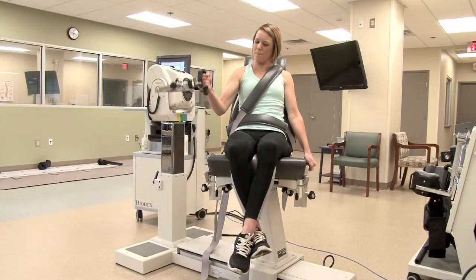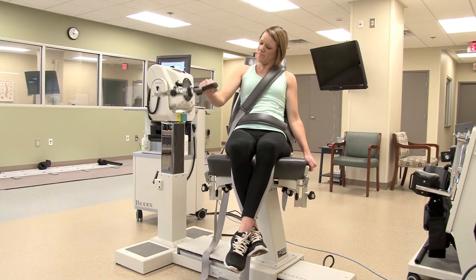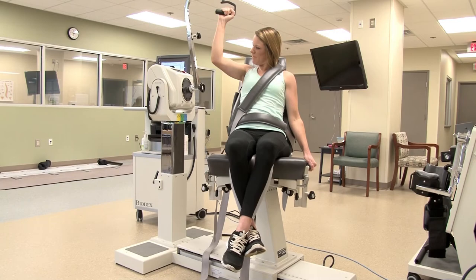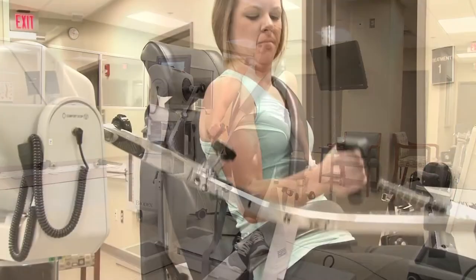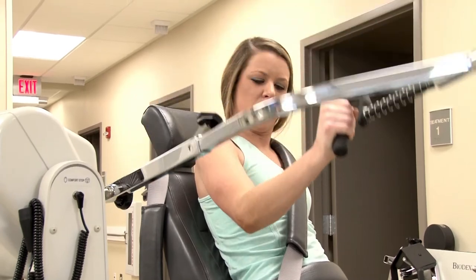The resistance coming from the isokinetic equipment is dependent upon that individual's capabilities. This makes it a safer approach — we're not putting a fixed amount of weight that someone would have to push and pull on.